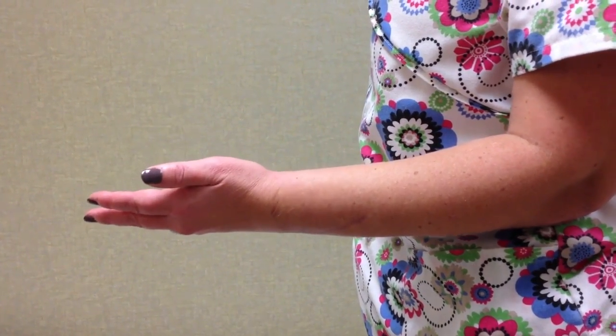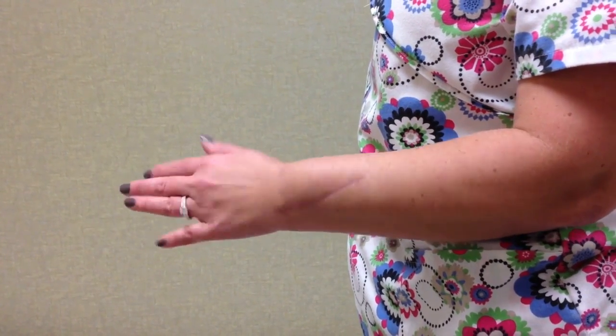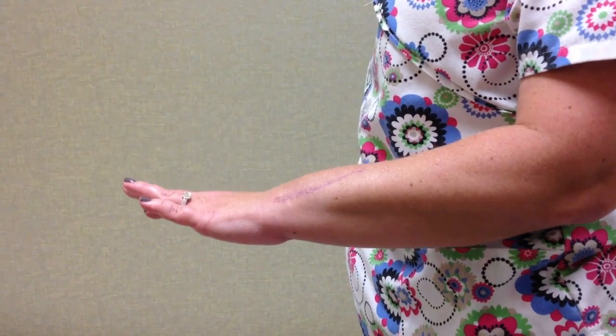Here's that same patient six weeks after Aptus arthroplasty. You can see the patient has regained the ability to turn palm up and palm down.